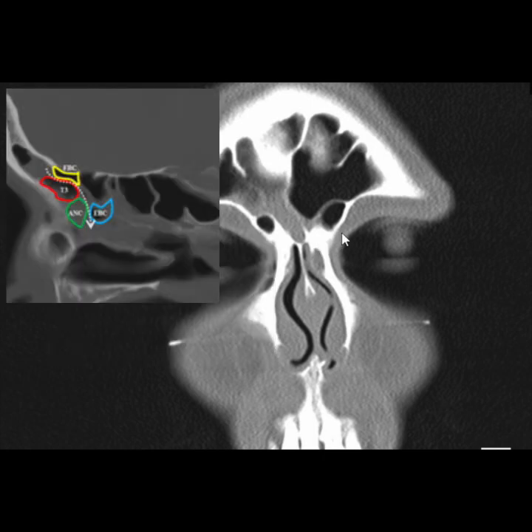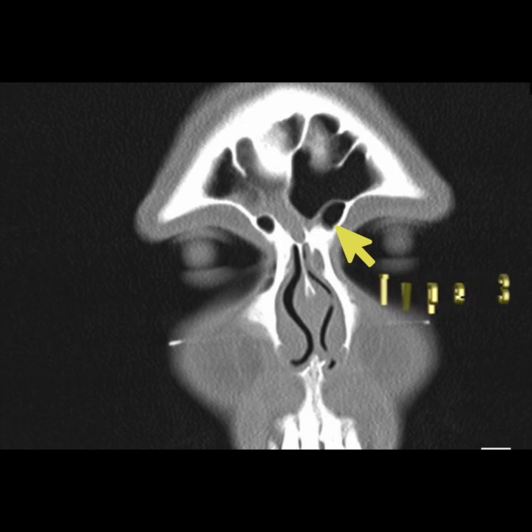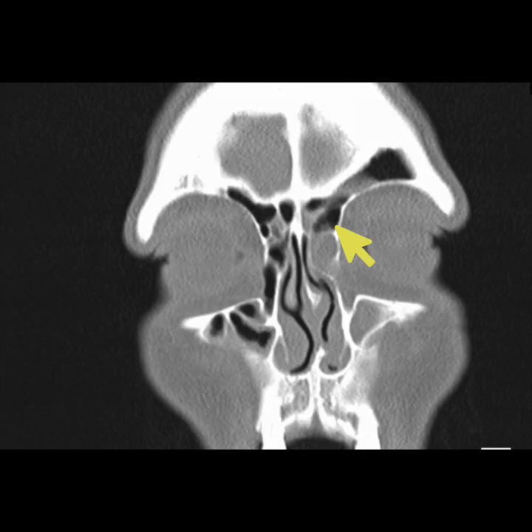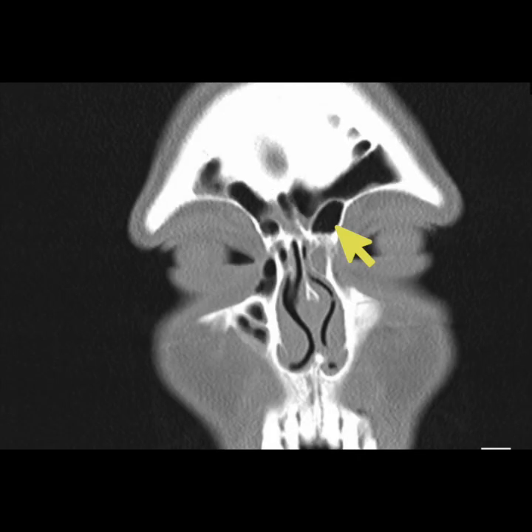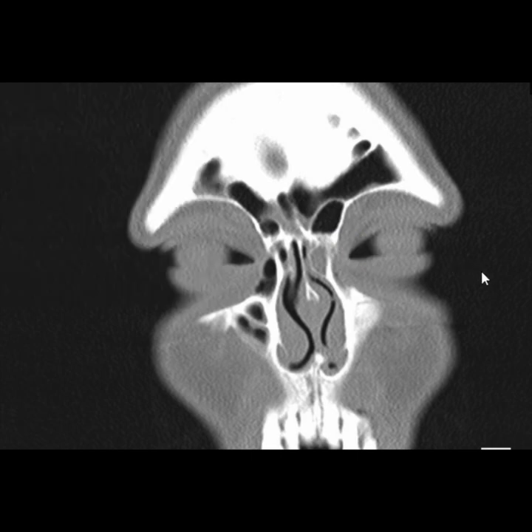Type 3 is a large pneumatization from the frontal recess into the frontal sinus — so from the frontal recess into the frontal sinus, this becomes a type 3 cell. To remember the type 3 cell: a part of its lower body is sitting on the frontal recess, considering this is the upper body. Let's have a look from a different angle.